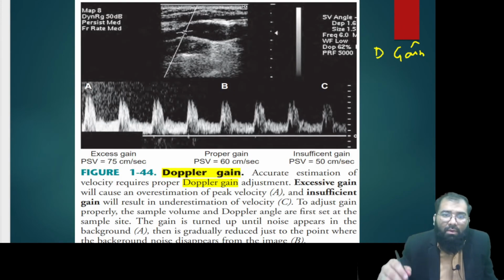Okay, let us see now. Look at this beautiful case here. Are you able to see that this is the ultrasound image and you are able to see this blood vessel? I'll trace it for you. So which image is this? This is grayscale image or B mode image. This is B mode image.